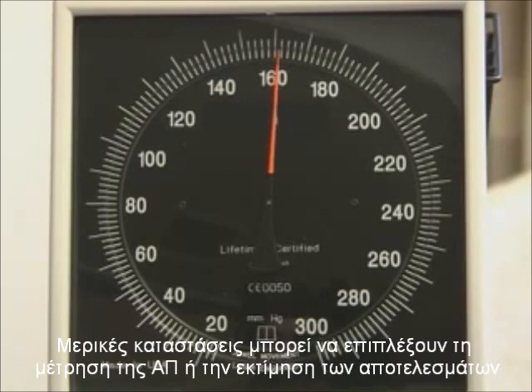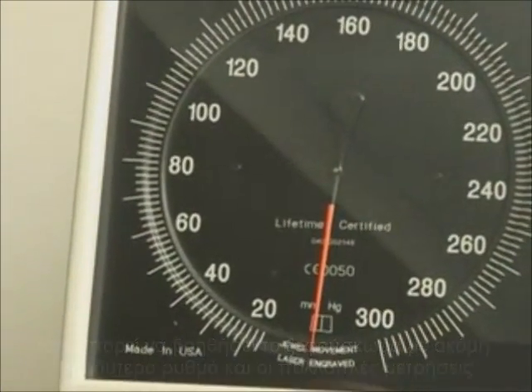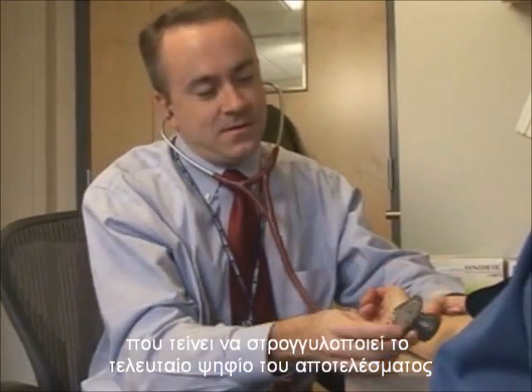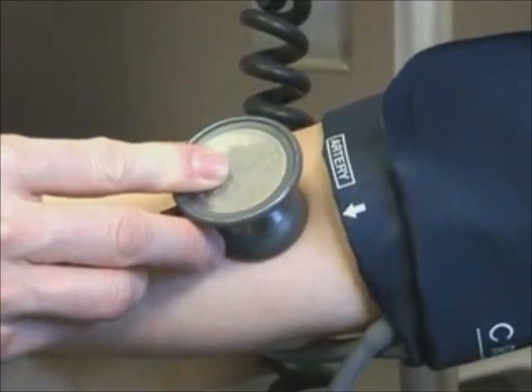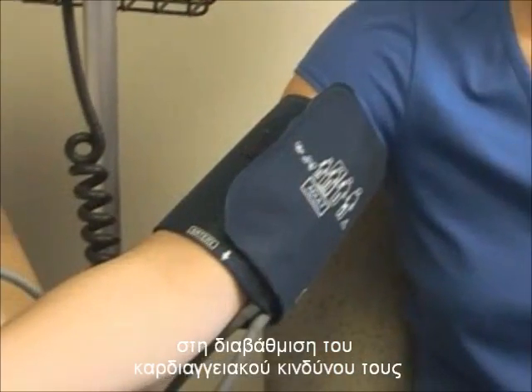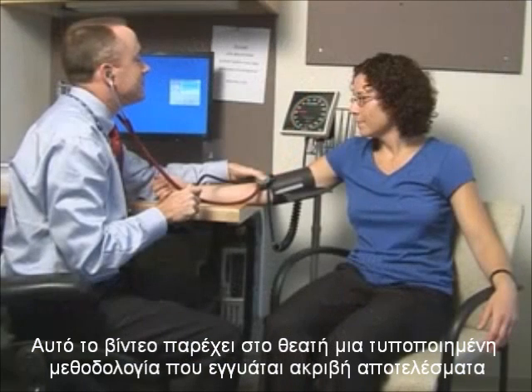Certain conditions may complicate blood pressure measurement or interpretation. In such settings, decreasing the rate of deflation and averaging several readings may improve accuracy. Observer bias is usually the most common error that occurs in blood pressure measurements. It occurs because practitioners often show digit preference and rounding of the terminal digit. When two people use the same correct technique for measuring blood pressure, there should be little inter-observer variation. Measuring blood pressure correctly is required to classify individuals, to stratify their cardiovascular risk, and to monitor the effects of treatment. This video provides the viewer with a standardized methodology that, when followed, will lead to accurate blood pressure measurement.